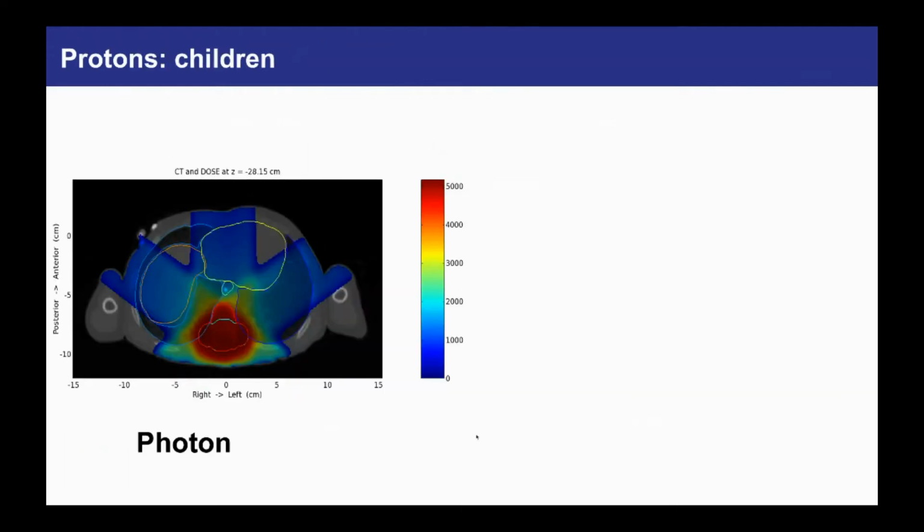So what does this mean in practice? Well, here's an X-ray treatment of a tumour that's located here. And you can see as we're delivering the treatment, most of the dose is going into the tumour, but we're putting a lower amount of dose into the surrounding healthy tissues around that tumour. And, you know, you can see here, we've got the lungs and the heart and the liver, and we're putting a small amount of dose into that. And obviously any dose is not particularly good for the patient. And so we want to minimise that dose to the healthy tissue while maximising the dose to the tumour.